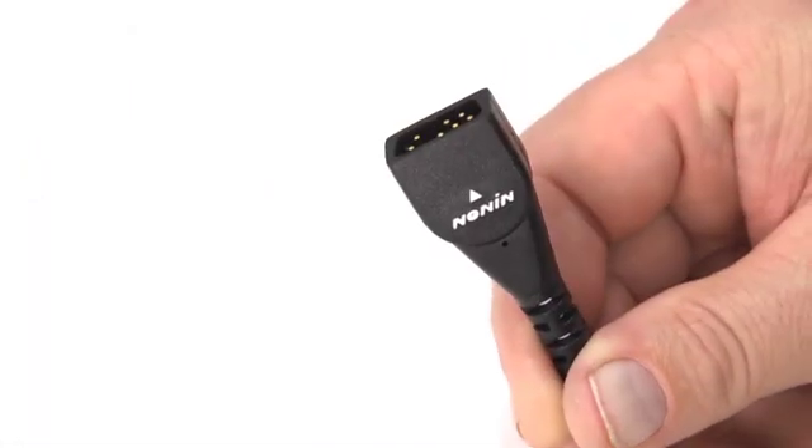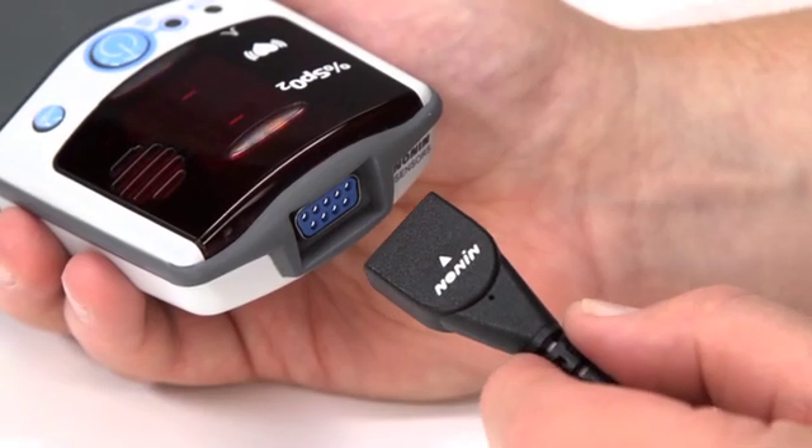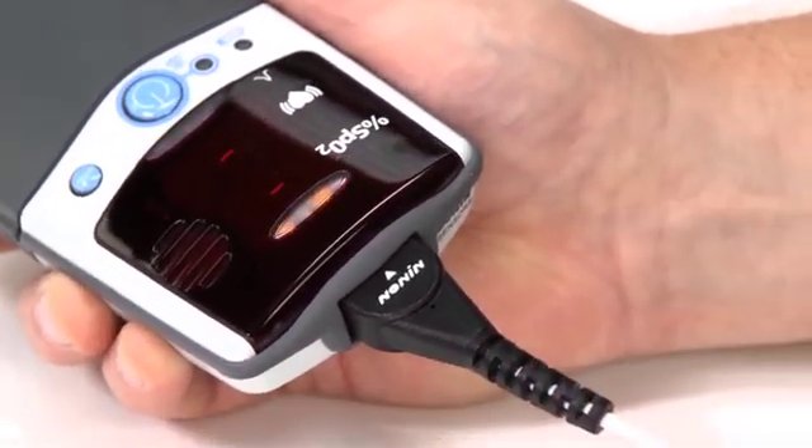Connect the sensor to the pulse oximeter by inserting the plug with the Nonin logo and arrow pointing to the top of the unit as shown here. The connector should firmly seat in the connector port on the oximeter.